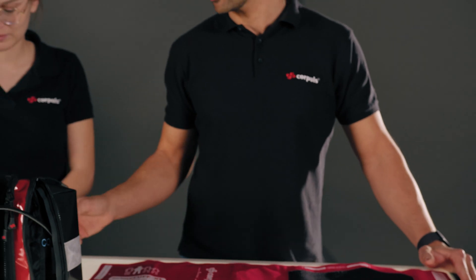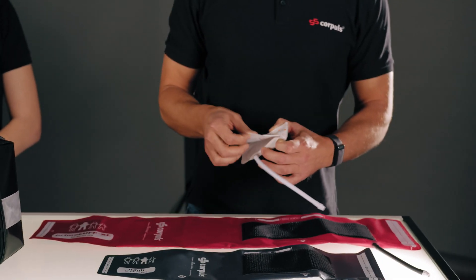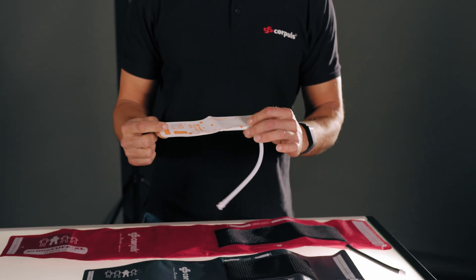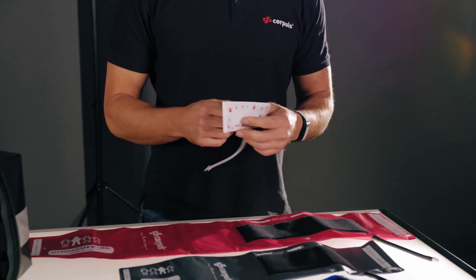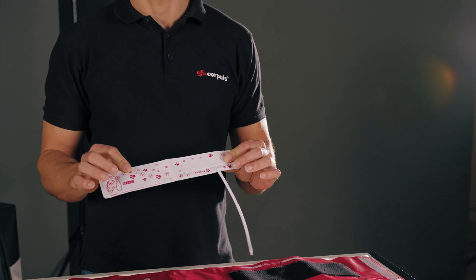All the cuffs are reusable, including short-term cuffs. This means they can be used up to a maximum period of seven days, and there are also disposable cuffs for single use. These are mainly for use in infants and neonates. At this point we would like to reiterate: please only use cuffs approved for the device.